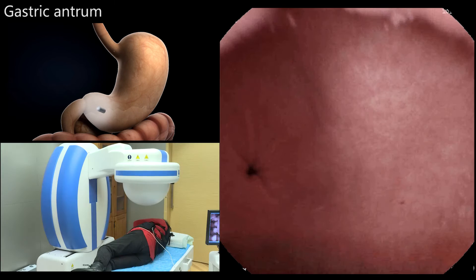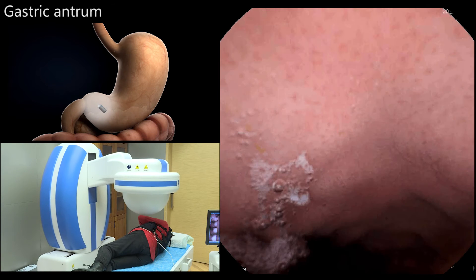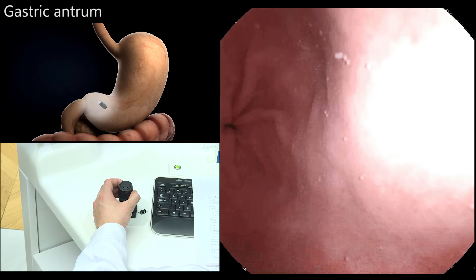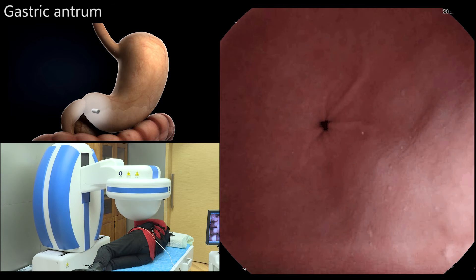The patient assumed the right lateral decubitus position. The capsule was lifted with the camera oriented obliquely upwards at 45 degrees. The camera was then horizontally rotated 360 degrees to observe the antrum and the junction of the gastric antrum and gastric body.